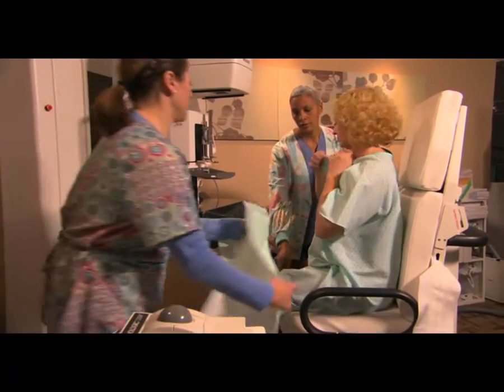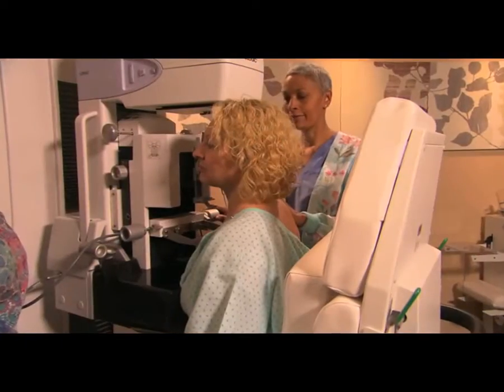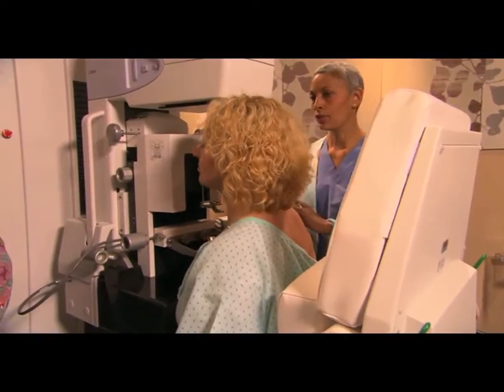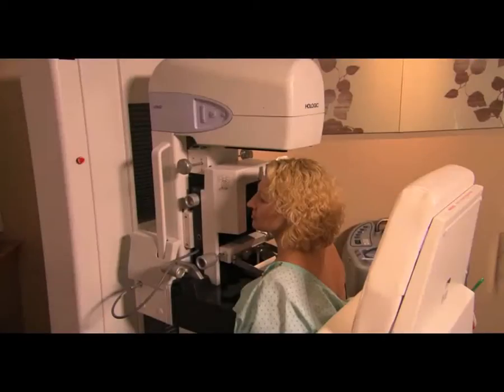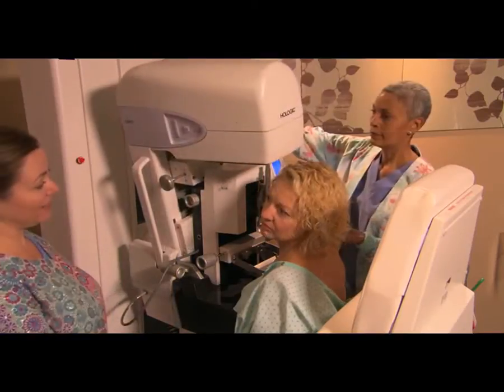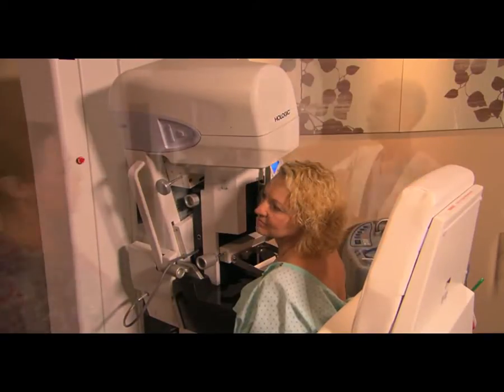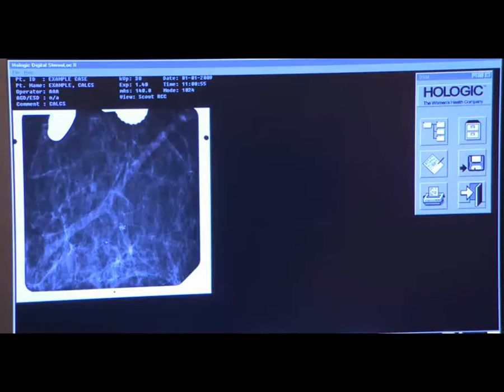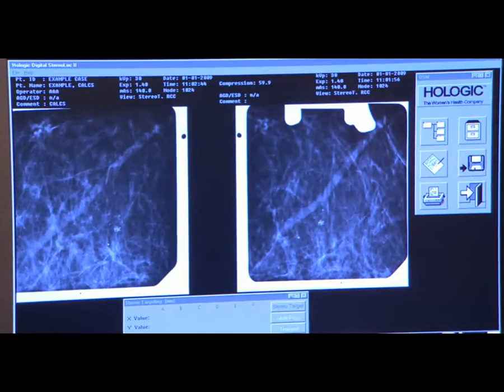First, you will get seated in front of the imaging system. Your breast will be carefully compressed into a fixed position, just like a mammogram. Then three x-ray images — center, left, and right — are taken. These stereo pictures will pinpoint the exact location to take the tissue sample.